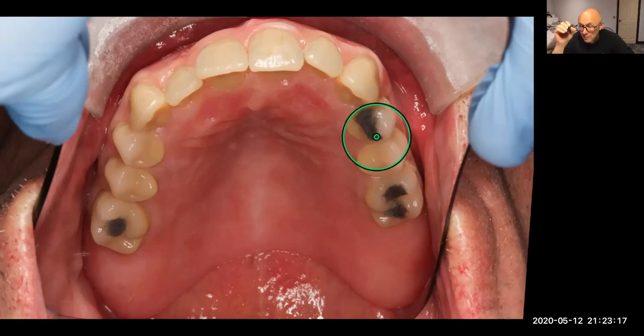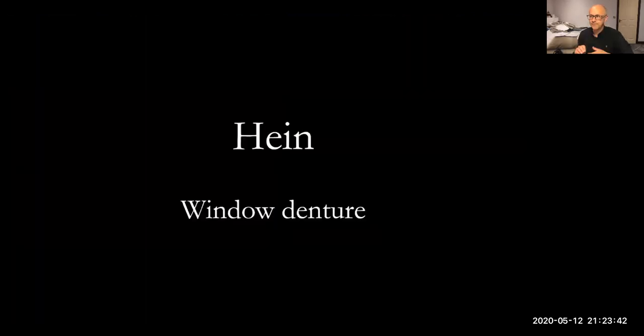So it's very simple. Just cut it out, sandblast, bond, put the filling in, light cure it. And the interesting thing is you've got to make it slightly scruffier than you would do normally for it to actually make a difference. So here's Ron. And he wanted it really characterized, and it just suited him. It's not right for everybody. So that's the characterization bit done.